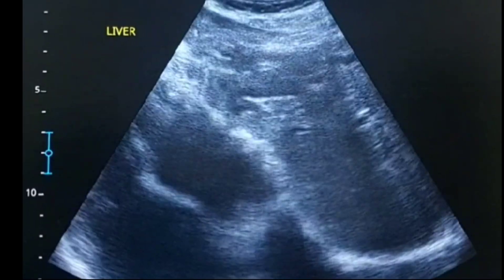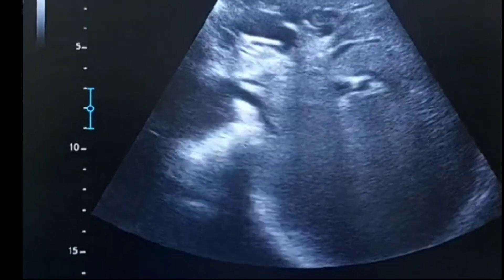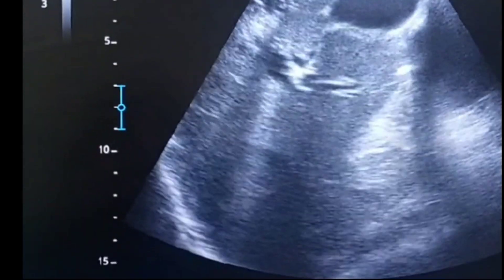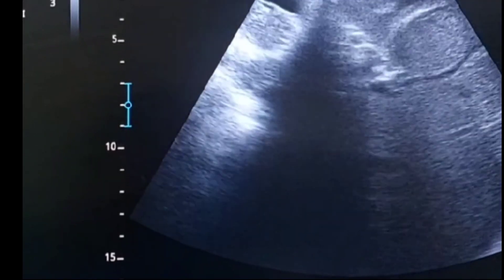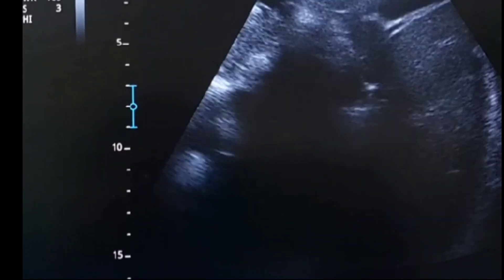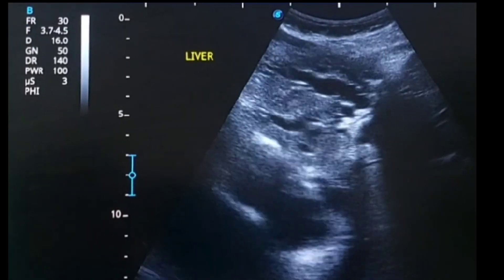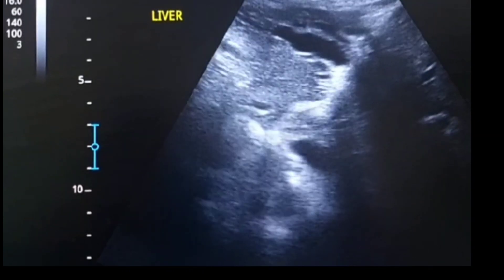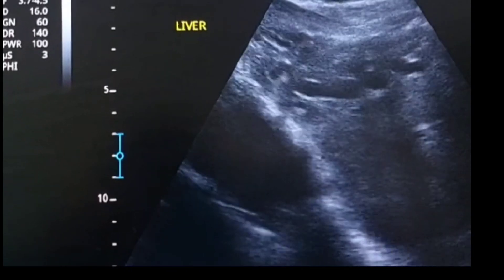In this video I have narrated how findings will appear on images and how to write the report. On this transabdominal scan, you can appreciate that the left lobe of the liver shows ectatic vascular structures. The right lobe is absolutely fine with no intraparenchymal abnormalities. The gallbladder is visible with no stones. The CBD and the left lobe show intraparenchymal dilated vasculature — these are intrahepatic biliary channel dilatations.